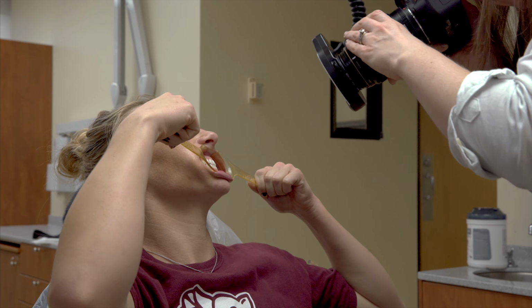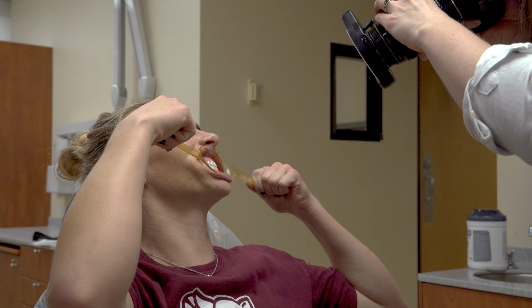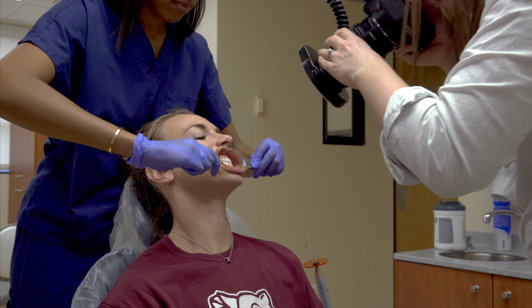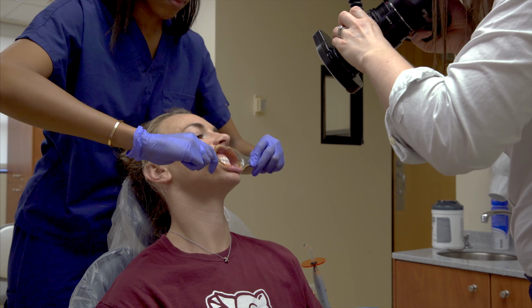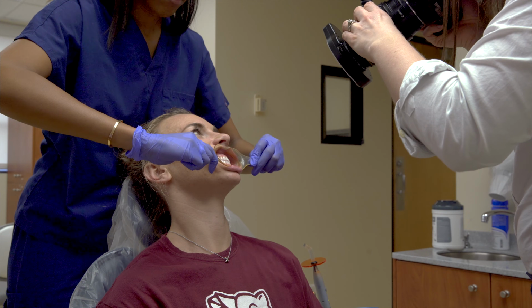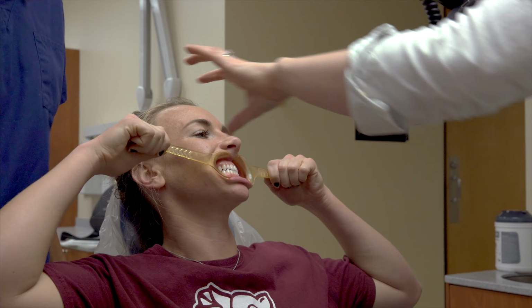For the anterior facial shot, place the plastic lip retractor so that the handle is parallel to the floor. To prevent the lips from bowing inward, pull the retractors forward towards the camera. Throughout all of these photographs, keep in mind that while your assistant may place the retractors or mirrors, the photographer needs to guide the assistant based on what he or she sees from the camera's point of view.